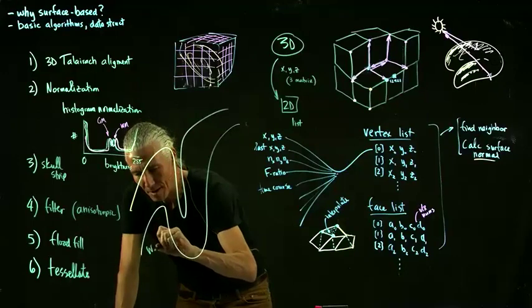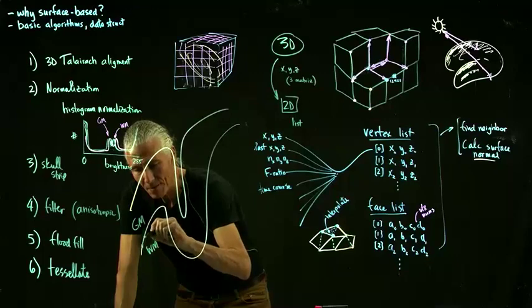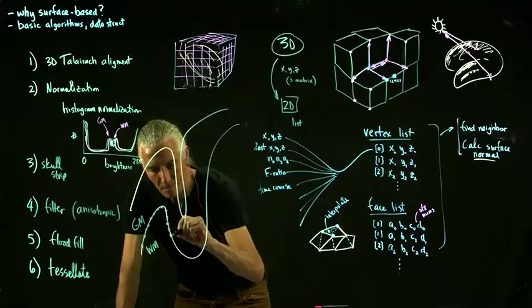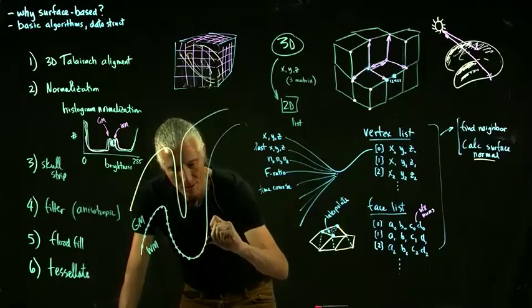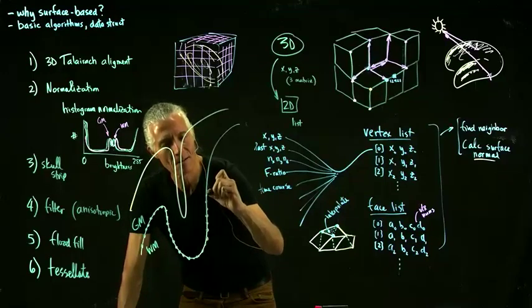So here's white matter and gray matter. So here's our surface, the vertices in our surface. And so they'll be pretty close to each other, usually less than a millimeter apart from each other, because we made this surface out of an MP rage that was a high-resolution surface.